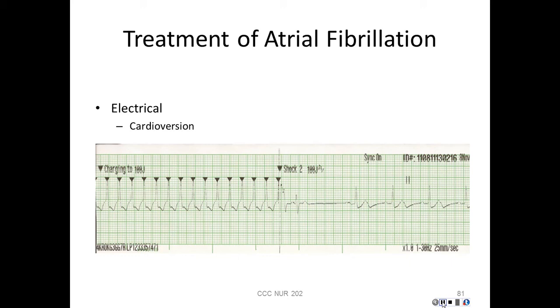Electrocardioversion is different from defibrillation. Electrocardioversion has to synchronize, and that's what these marks are, basically the machine synchronizing on the R wave of the QRS. The R wave is the first upward motion of the QRS. What will happen is you may push the button here, but it's not going to fire until that R wave comes along.